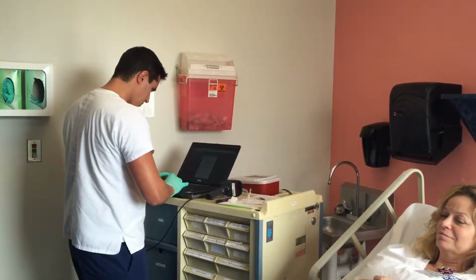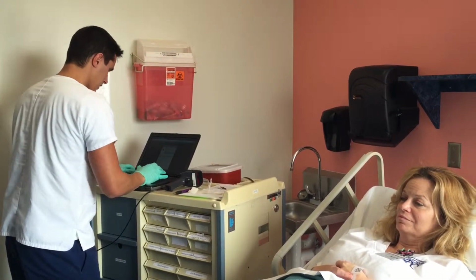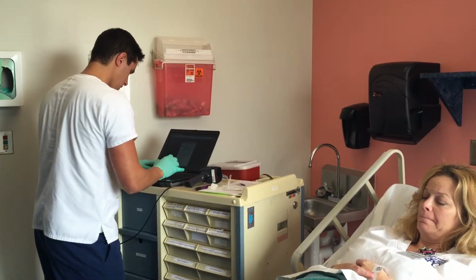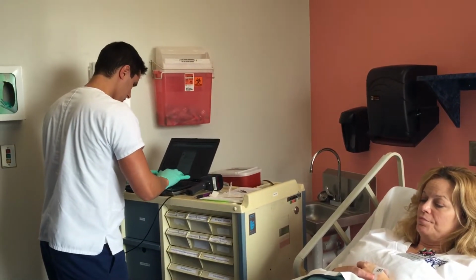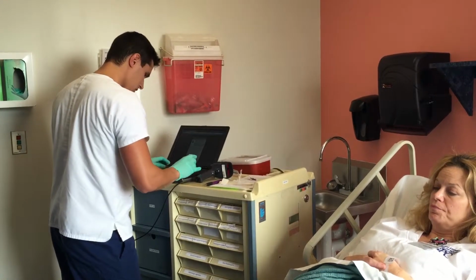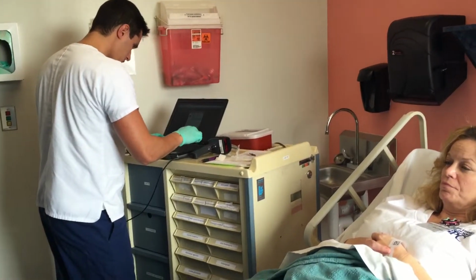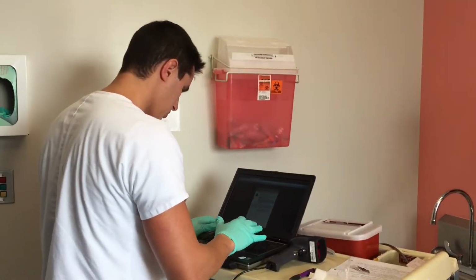We'll chart the time. We'll say the glucose was 290, and that's why we gave 16 units of regular insulin. And my initials.